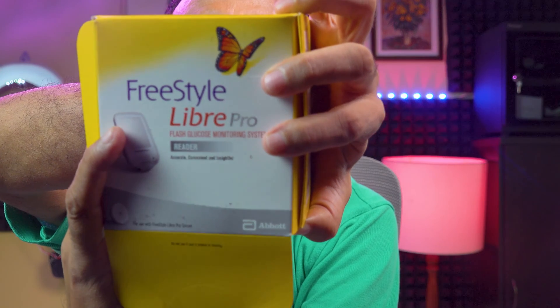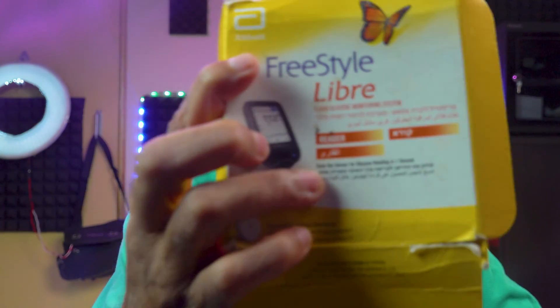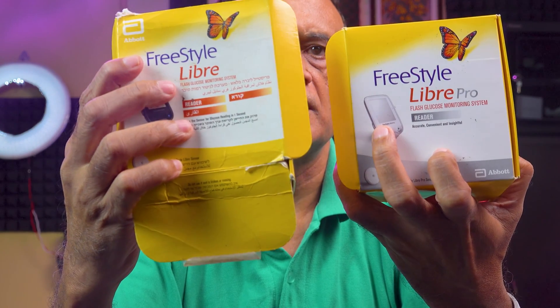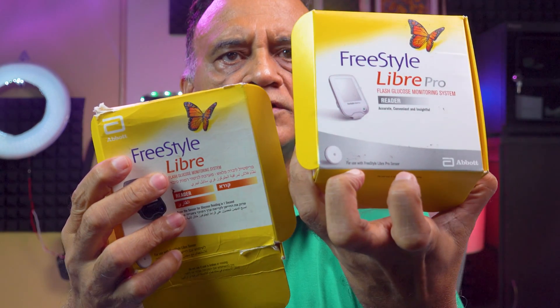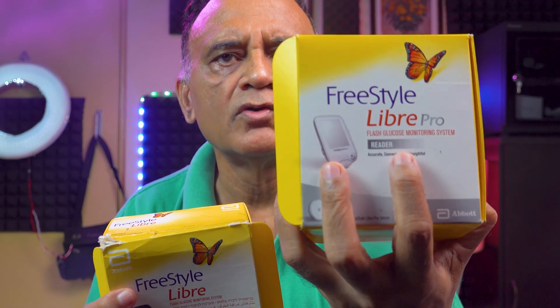The next step is to activate the sensor with the reader. I am now going to open this package — this is the Freestyle Libre Pro Reader. This is to be differentiated from the Freestyle Libre Reader, which I have been using previously. You can see that the external appearance is also different: the Libre Reader is black and the Libre Pro Reader is white.